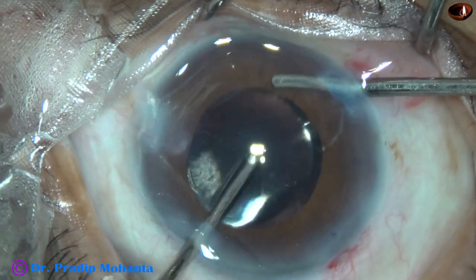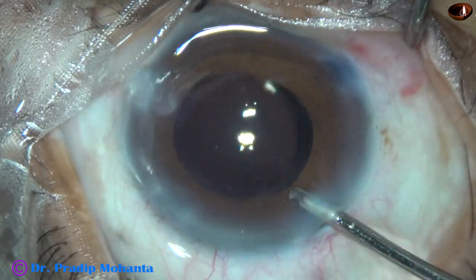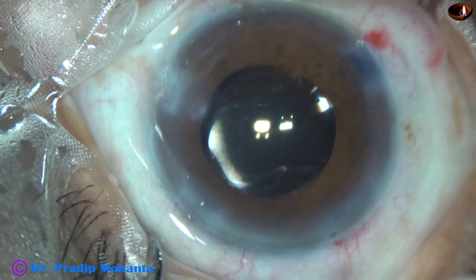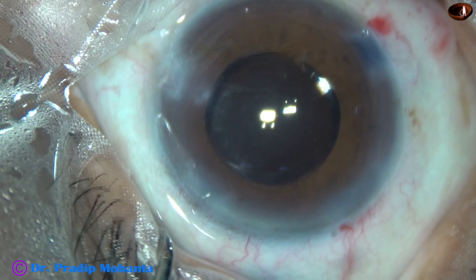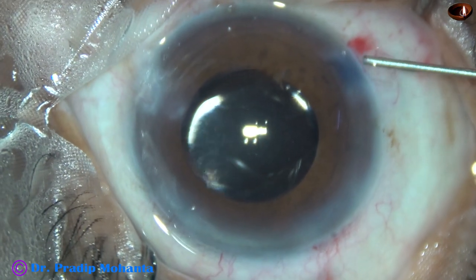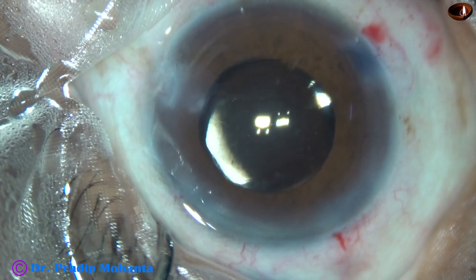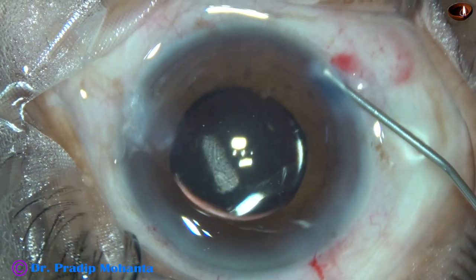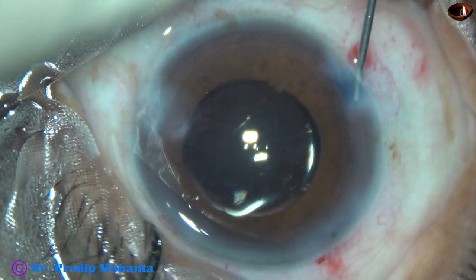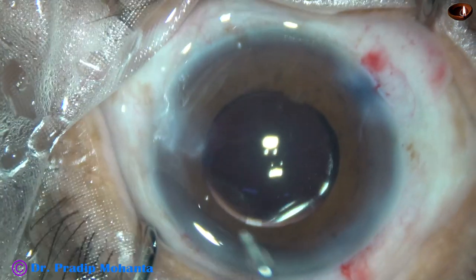This is almost an unedited video, so you are watching each and every step of the surgery. A bit of Moxifloxacin is injected into the anterior chamber. I usually use it at this time. Then I hydrate the corneal stroma on either side of the stab incisions. Then I do a final lavage of the anterior chamber with 23G SIMCO and conclude the case.